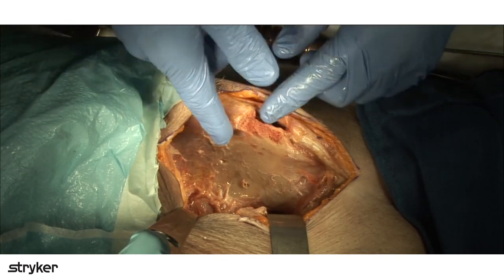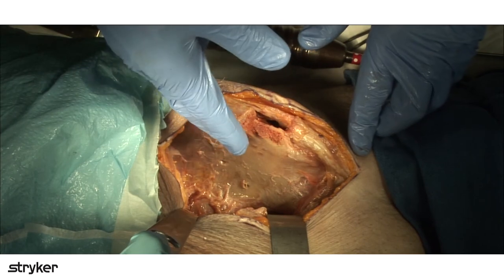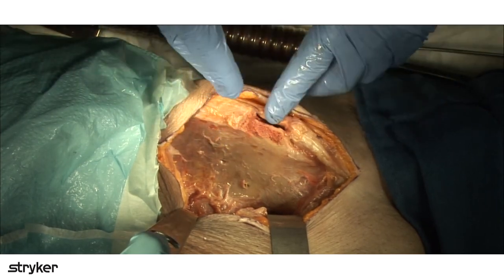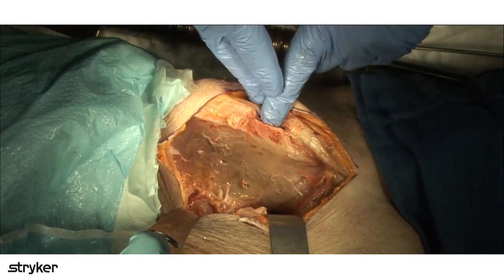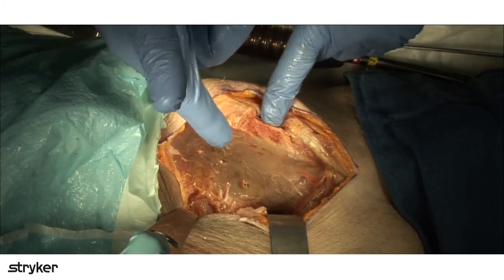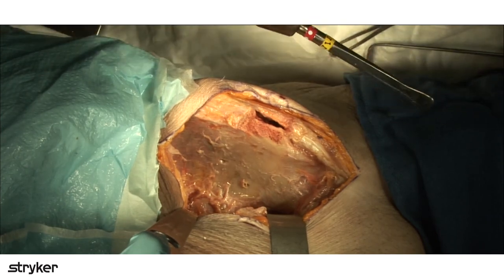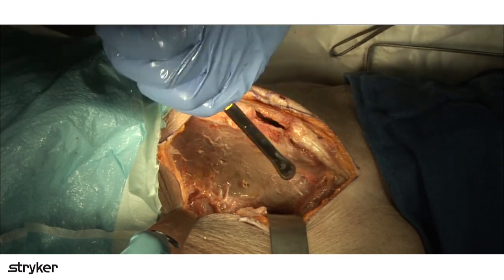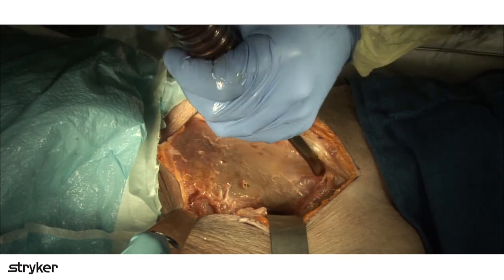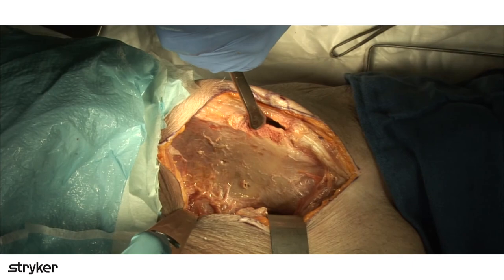You're not as limited by where the actual holes in your suprapectineal plate are, and you have more options for some independent posterior column screws. It gives you a better shot down medial to the joint. It gives you a lot more flexibility in terms of where your fixation corridors can go. And certainly if there's an anterior wall that's a significant component of your fracture, I think this is very useful.